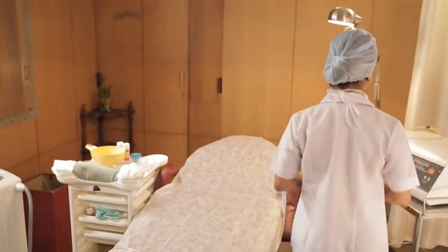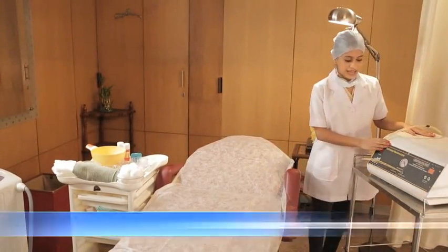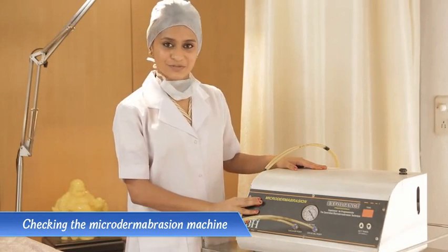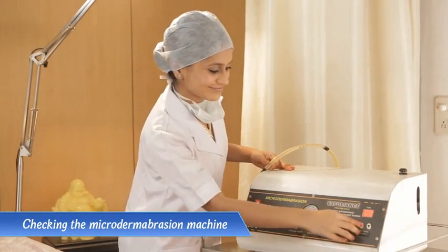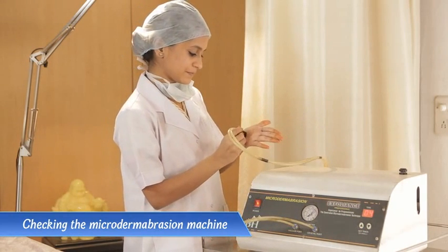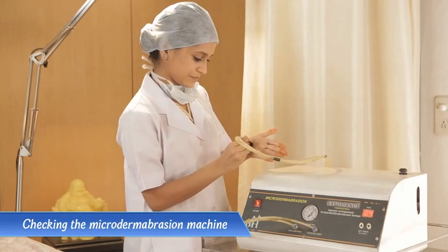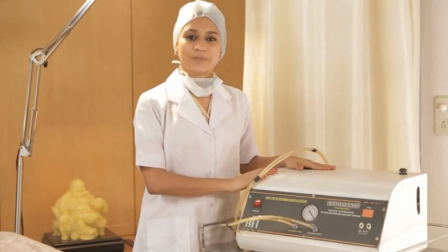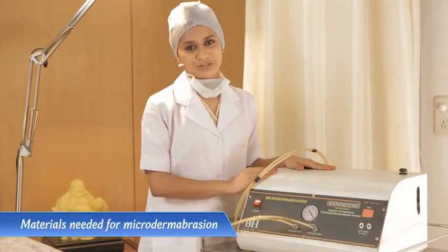Hi friends, as you can see I'm ready for Mr. Arun's treatment. I'm now checking the microdermabrasion machine for powder flow and suction pressure. The machine is prepared for treatment. Now let's have a look at the trolley.